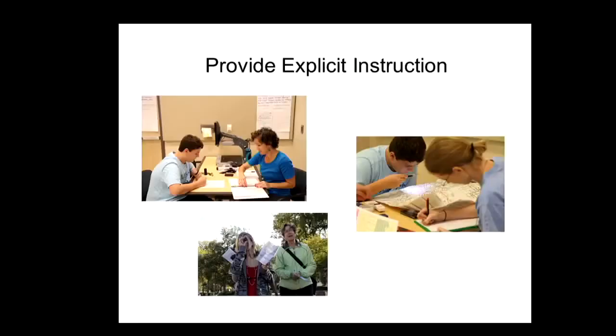So the next photos show on the top left a student participating in a sustained reading task where he's working to handle that continuous text. On the lower left is an outdoor setting using the telescope to find birds or dogs or cars moving. There can be in different settings action that interests the student. And then on the right is a student working with a map and some charts, developing the skill, search strategies, and figuring out how to break down more complex material.